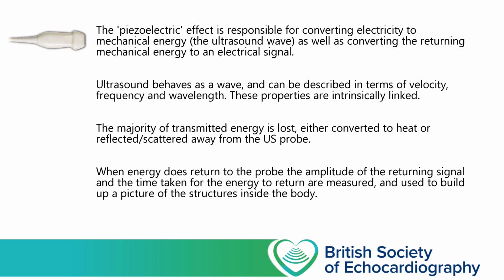Alright, so that's it. That's our brief introduction to the physics of ultrasound, and how we can use it to create two-dimensional images of the moving heart. I think we'll finish by summarising some of the key things we've discussed during this lecture. So first of all, the piezoelectric effect is key. This is how we're able to convert electrical energy into kinetic energy that we can send into our patient, and how we're able to convert that returning kinetic energy back into electrical energy that we can detect.